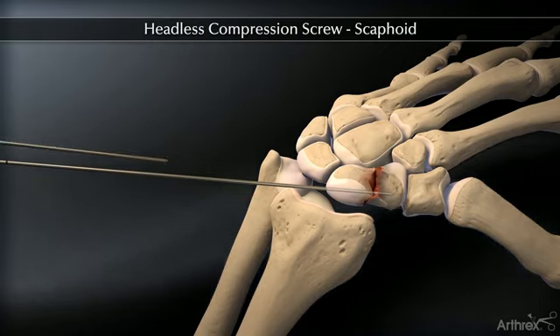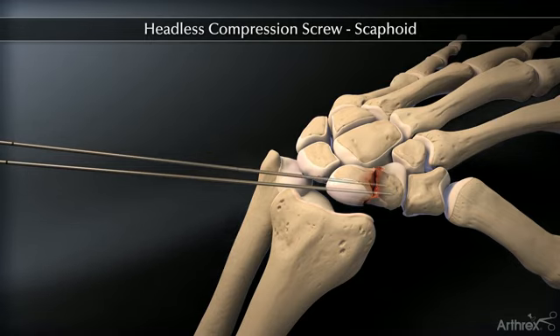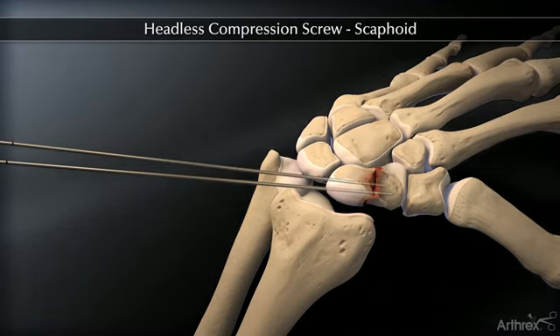If the fracture is unstable, it may be helpful to place a second parallel guide wire using the appropriate parallel wire guides.